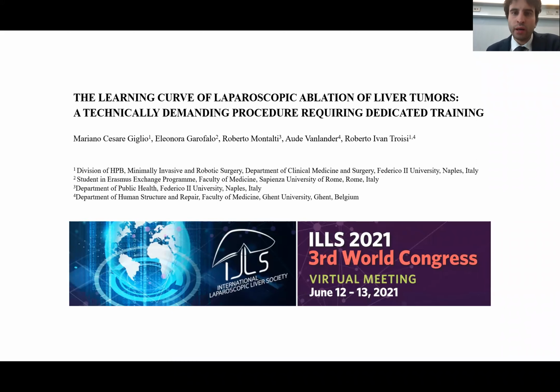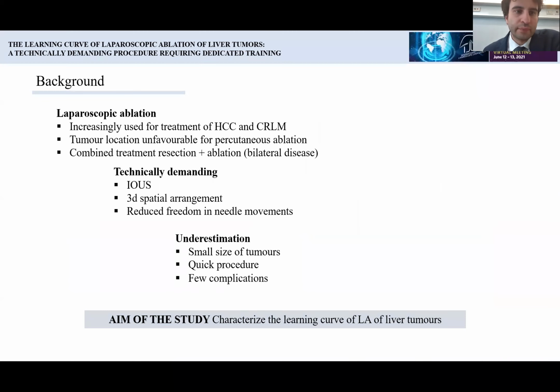Good morning, everyone. In this time, I will present to you a study about the learning curve of laparoscopic ablation of liver tumors. So, laparoscopic thermal ablation is an increasingly used technique for the treatment of colorectal liver metastases and hepatocellular carcinomas.